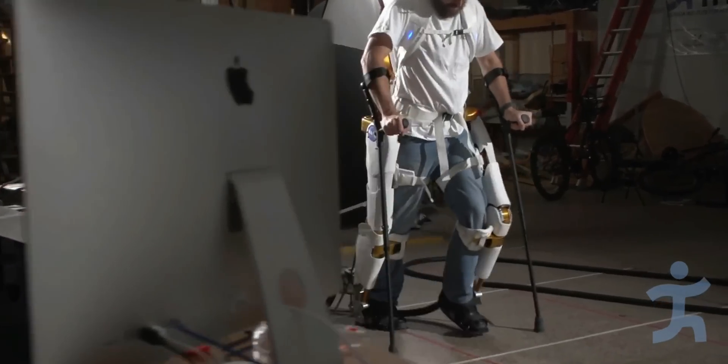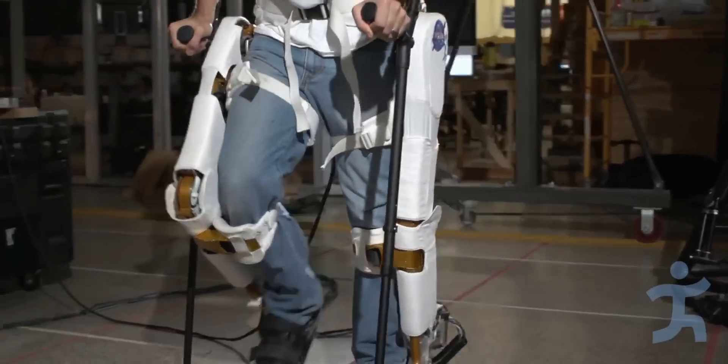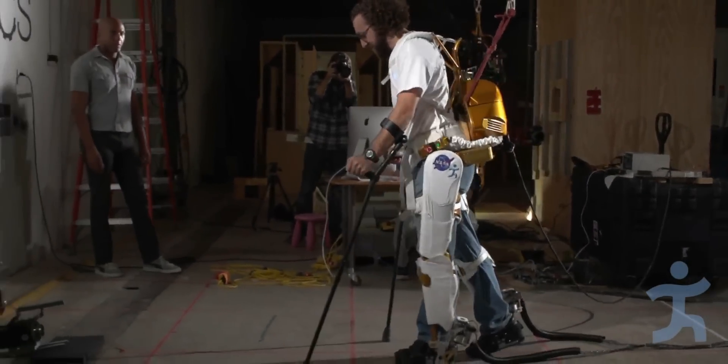We've developed the X-1 robotic exoskeleton in conjunction with NASA Johnson Space Center. The X-1 has powered joints at the hips and the knees, but the ankles are fixed, meaning there's no assistance. And we know that the ankle is an important joint in walking — they provide a good amount of force during toe-off, which helps generate dynamic walks.